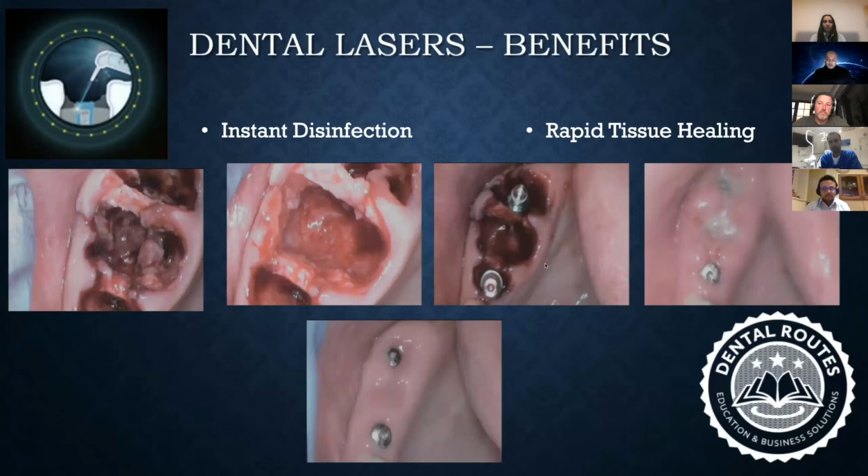Okay, so I placed the implants at the same time, and I augmented the whole socket at the same time. What I've achieved by doing all of this is one, time, and second, the amount of tissue management. So I know that whole tissue is healing up nicely within the infrastructure that is put in there. The scaffolding is there, so the tissue doesn't disappear.